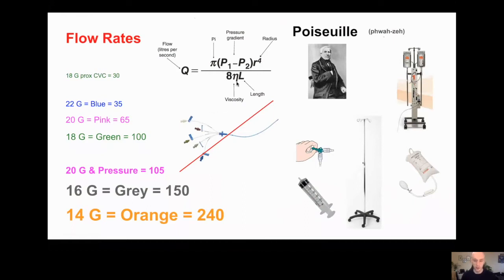Other factors, viscosity, we can't really change that, but pressure we can. So this is a level 1 transfuser. We see them in obstetrics. It's essentially a pump that warms the fluid up, and it can put in significant volumes very quickly. Often you need one person dedicated just to manage the fluids going into it. But I want to tell you that you can make one of these.